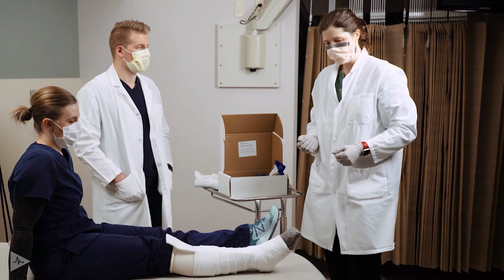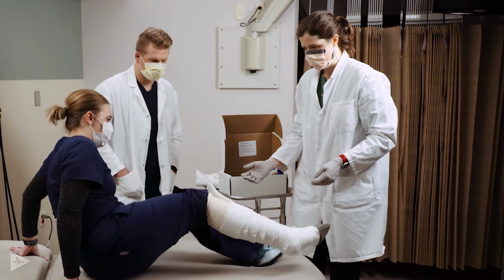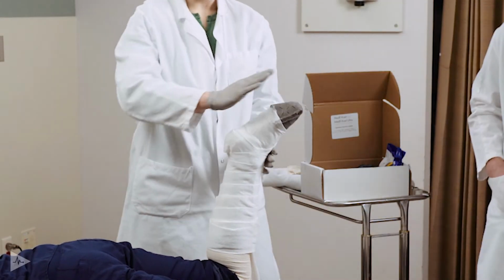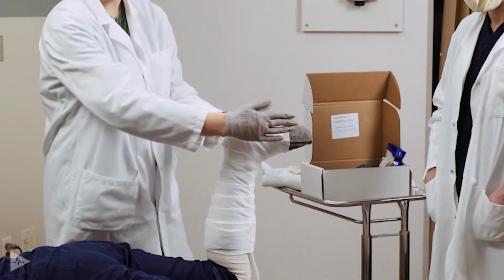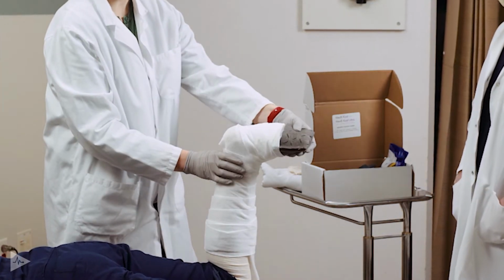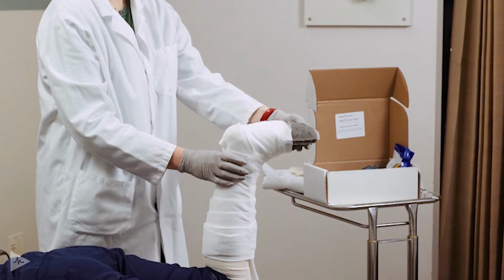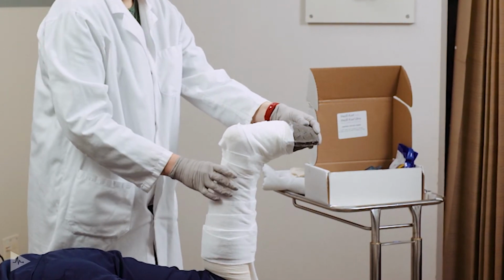At this point then, I will usually have the patient roll onto their stomach. We'll have the leg bent for easier application of the cast. We want to try to keep the foot at about a 90-degree angle, and we want the ankle lined up with the leg. So we don't want the foot to deviate inward or outward, and we want to try to keep a 90-degree angle. And that's where a helper can be beneficial, helping to hold that foot in place as the patient is trying to relax.